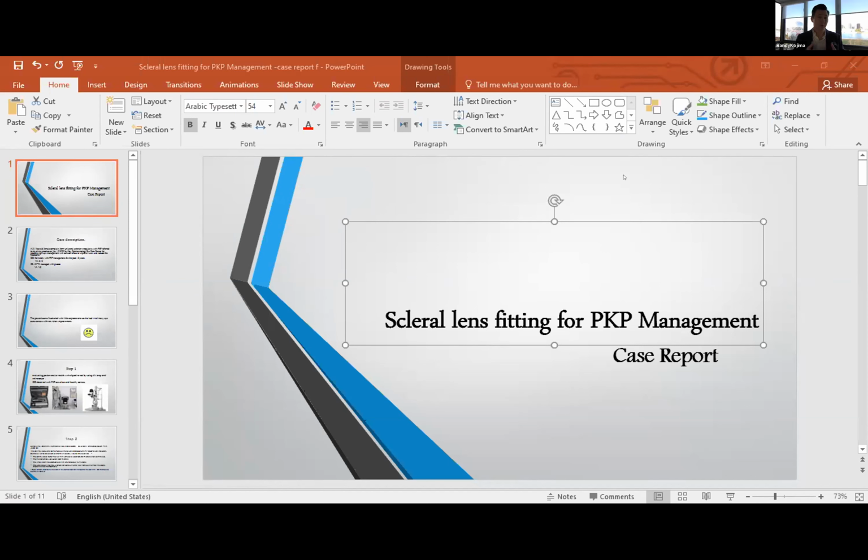What you can do to determine if you have the right relationship with the sclera is put the scleral lens on without fluorescein. So no fluorescein behind the lens, no fluorescein in the eye. Then set the patient up behind the slit lamp and observe, make sure your magnification is right, everything is in focus, and then tap a fluorescein strip to the front of the eye and immediately observe: do you see fluorescein getting in somewhere behind the lens?